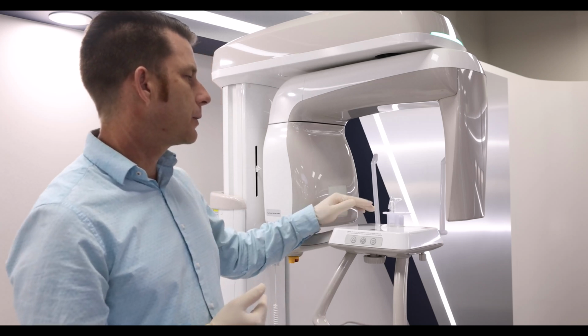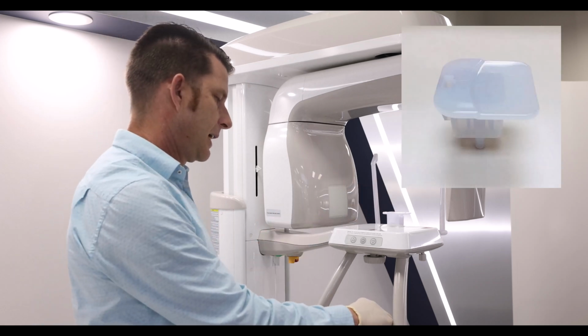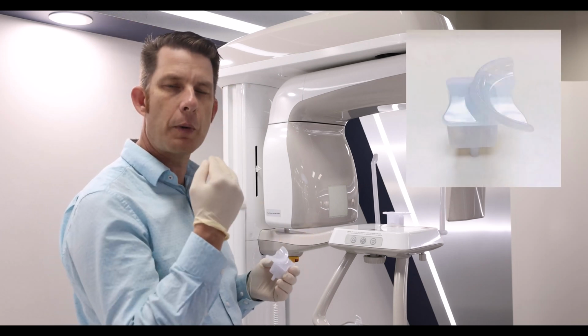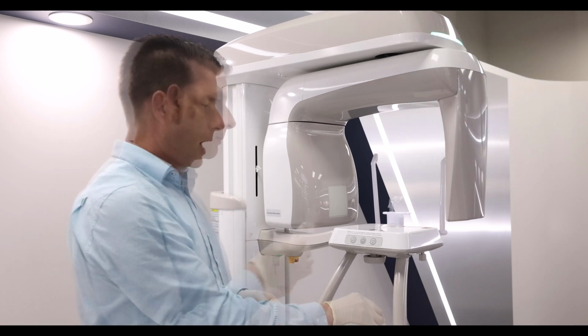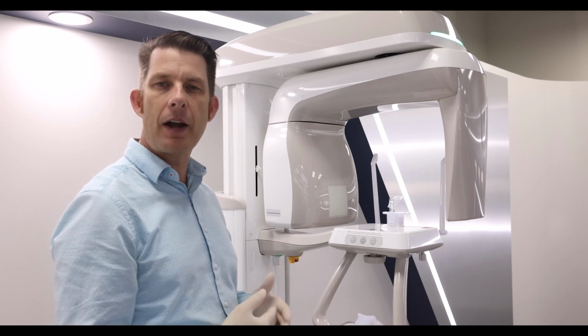We'll review PaX-i panoramic patient positioning, Bitewing positioning, and other specialty modes for the PaX-i device. The PaX-i includes a chin rest with bite stick, also includes your edentulous cup. This will be used for patients who are missing anterior teeth, fully edentulous, or have troubles biting in the bite stick groove. I'm going to go ahead and initialize our device, and we will bring our patient back for panoramic capture.